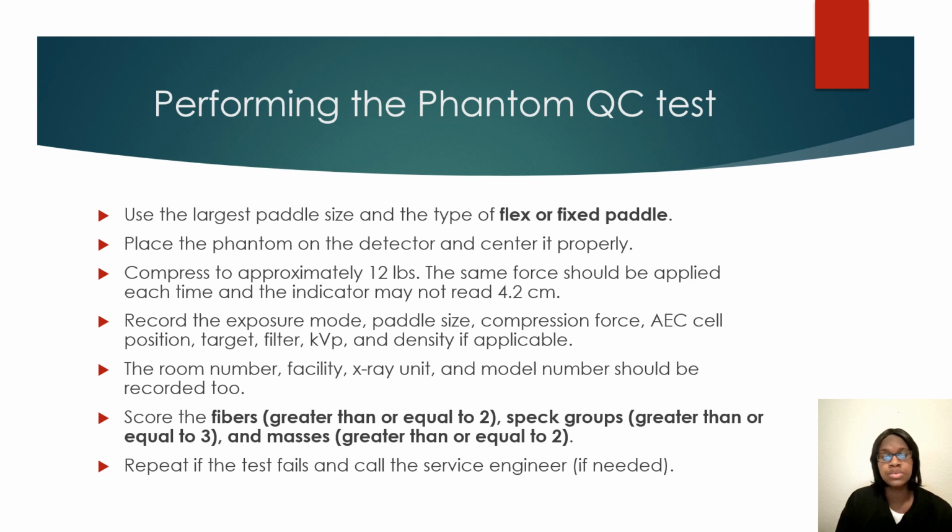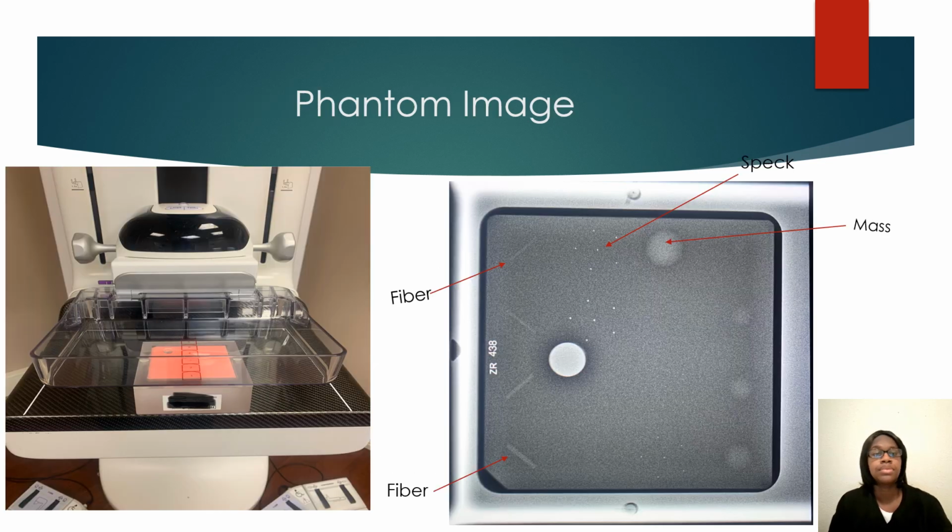Score the fibers greater than or equal to 2, speck groups greater than or equal to 3, and masses greater than or equal to 2. You must repeat any test if it fails and call the engineer, the service engineer.